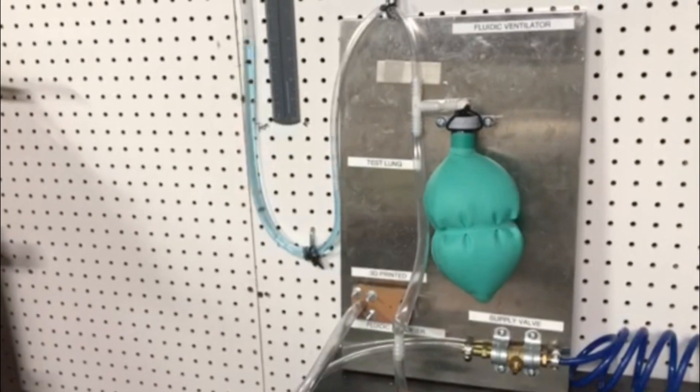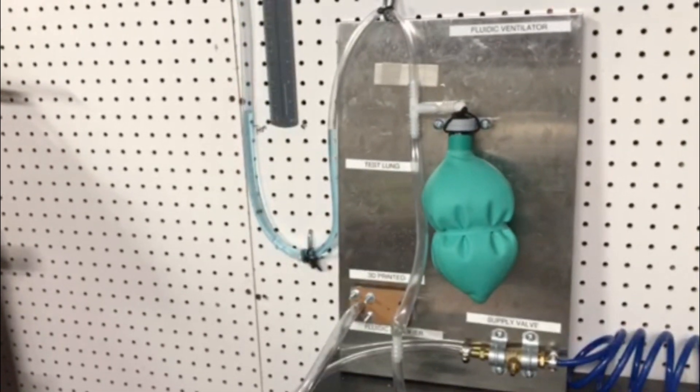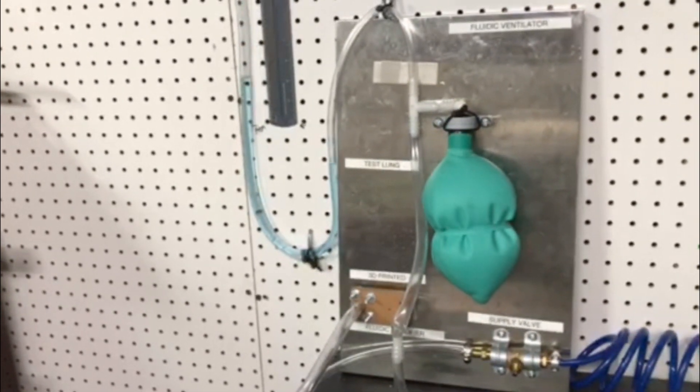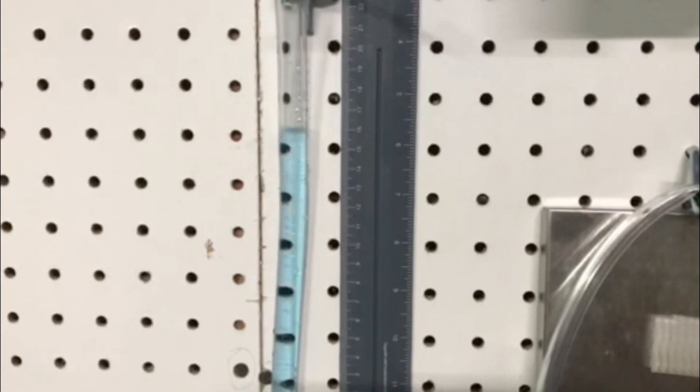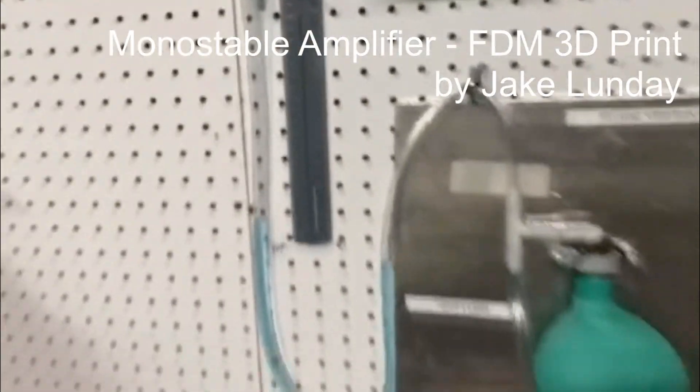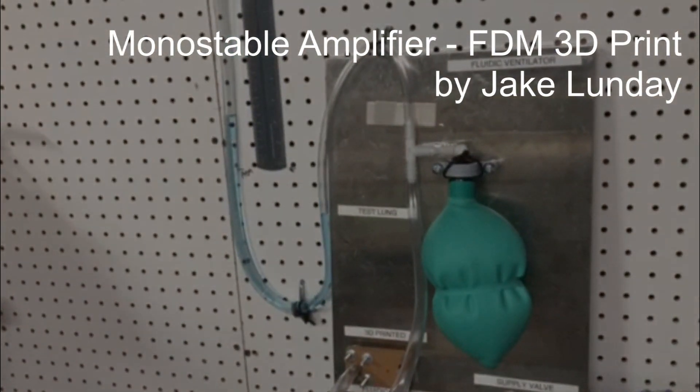And here's another design by Jake Lundy, who uses a different fluidic concept to perform the same timer effect. You can see the different pressures reached in the liquid pressure sensor on the left. We call this measurement device a manometer and it can be made by anyone with simple tubing and some water.